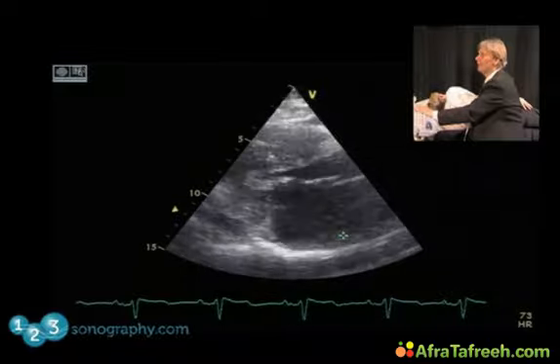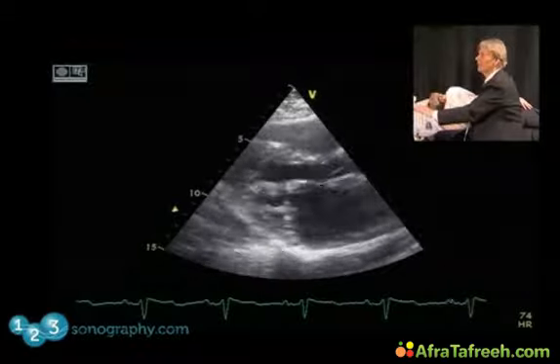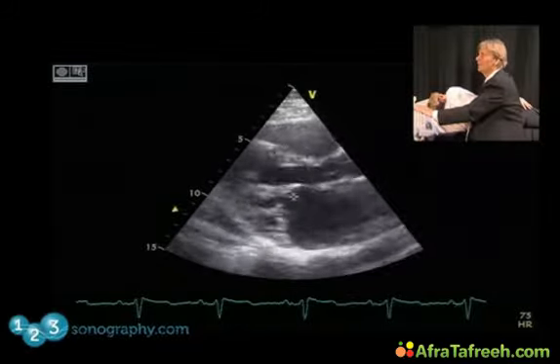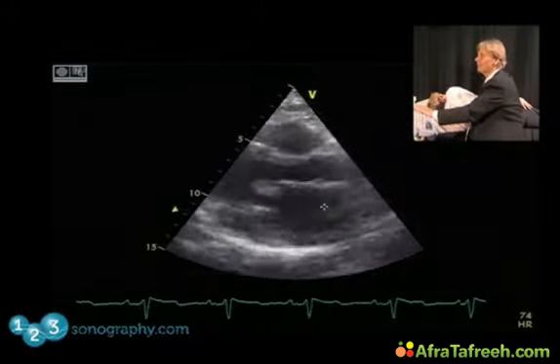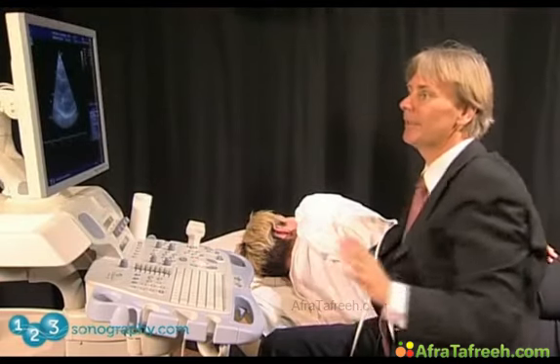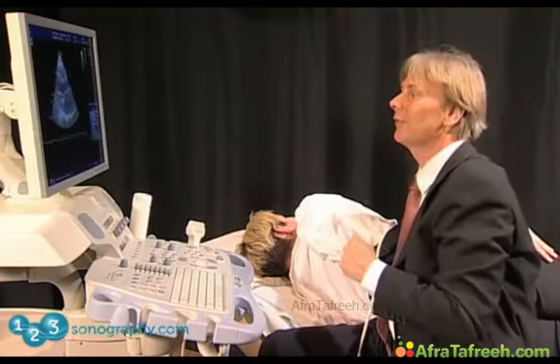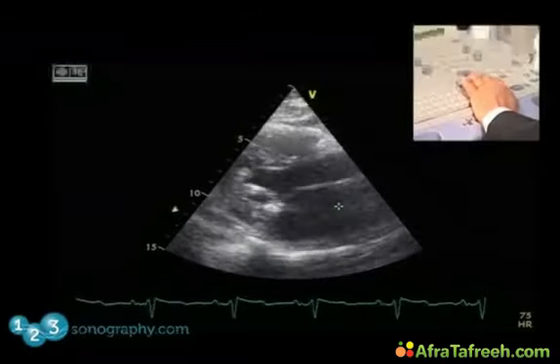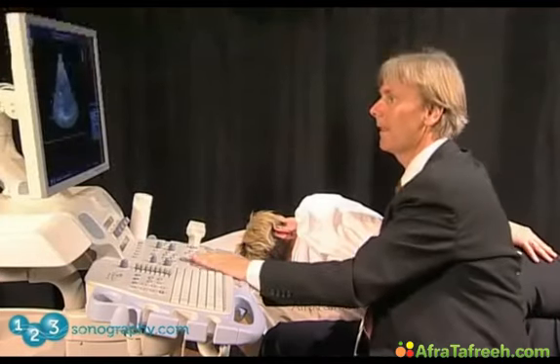look at the subvalvular apparatus. So this is the tendinae, the papillary muscles, and you can appreciate the thickening of the subvalvular apparatus as well. This is a typical spectrum of changes that you see following rheumatic heart disease, with doming of the anterior leaflet as the leading problem in this patient.